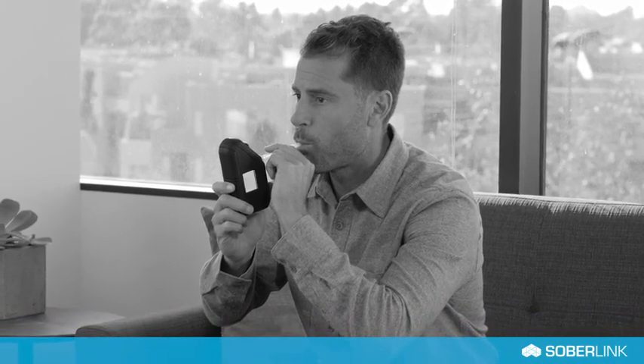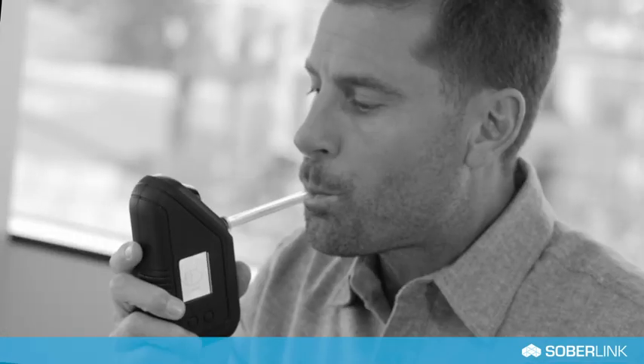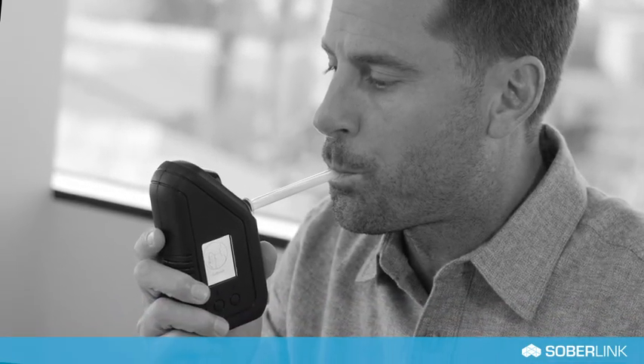Please follow these best practices when submitting a test. Do not hold the mouthpiece or obstruct the camera. Remove any headwear and or sunglasses. Always use the provided Soberlink mouthpiece. Make sure the device is directly in front of you with the mouthpiece parallel to the floor.